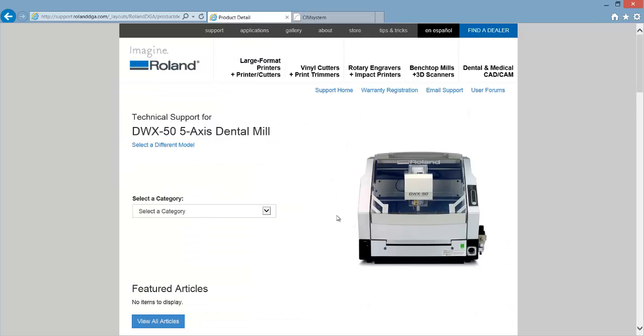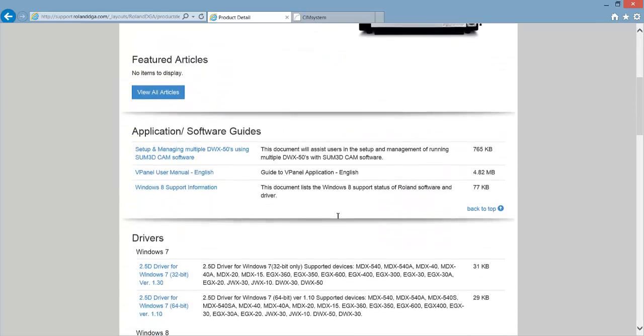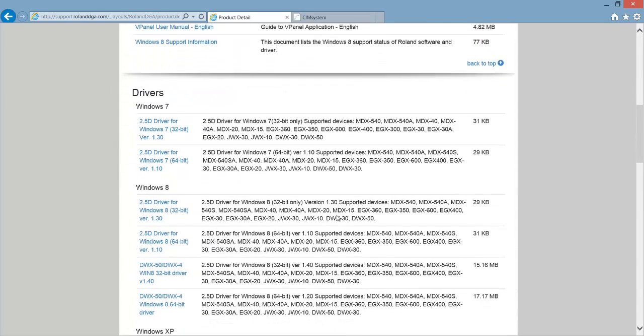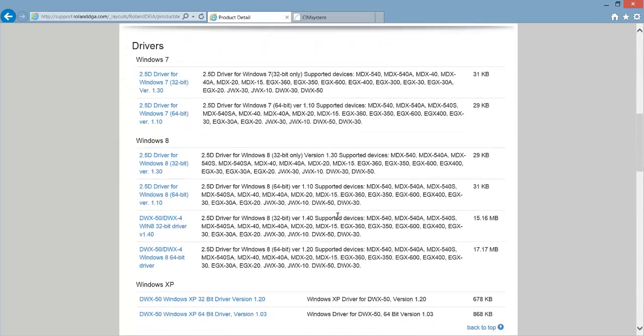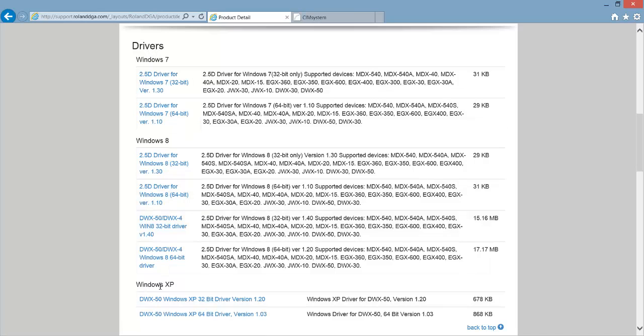When that page loads scroll down and you'll have some options for different downloads. The first download you need to get is the driver update. To do this scroll down to drivers and then go to the appropriate operating system.